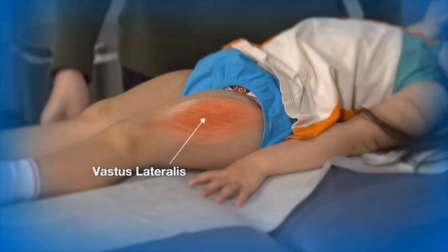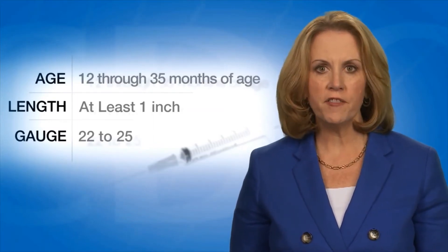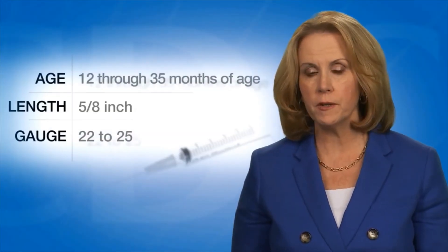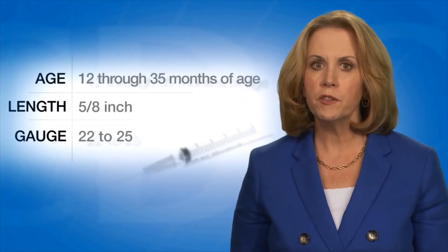The vastus lateralis muscle on the anterior lateral thigh is the preferred site for toddlers 12 to 35 months of age. To penetrate the muscle, use a 22 to 25 gauge needle at least 1 inch long. The deltoid muscle in the upper arm can also be used if the muscle mass is adequate. A 5/8 inch needle is adequate only for the deltoid muscle and only if the skin is stretched flat between the thumb and forefinger and the needle is inserted at a 90 degree angle to the skin.